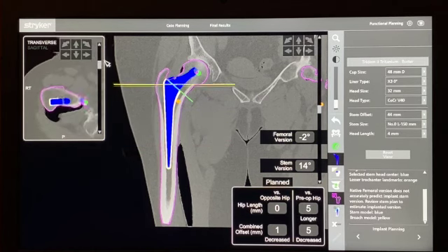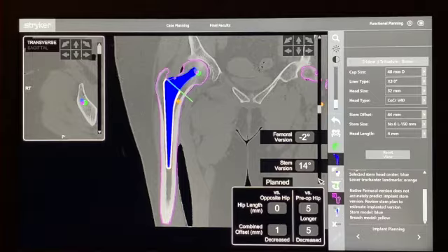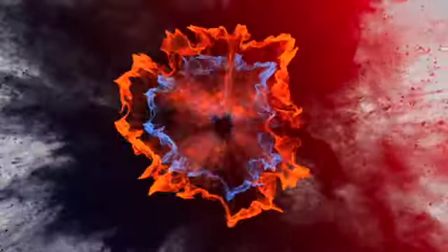That's my femoral stem now planned. The next stage of planning, using the MAKO 4.0 software, is functional planning and virtual range of movement assessment. You'll find this in the next educational video from Melbourne Hip and Knee.